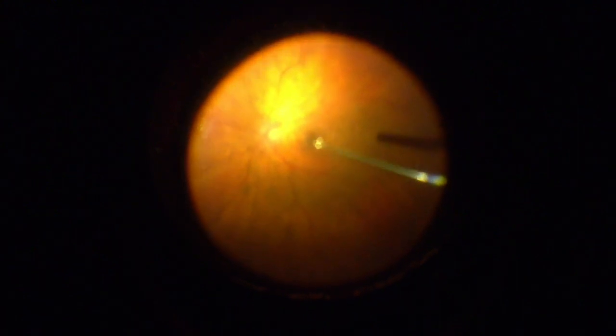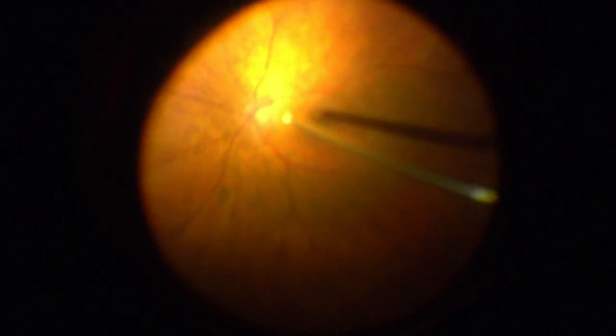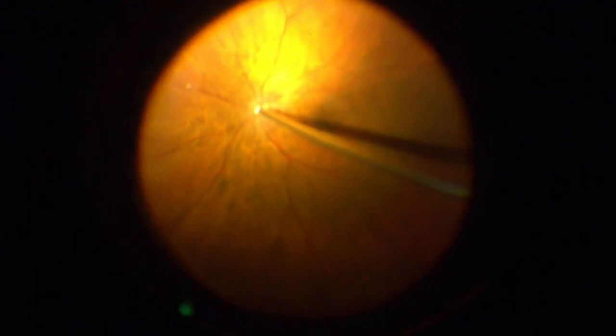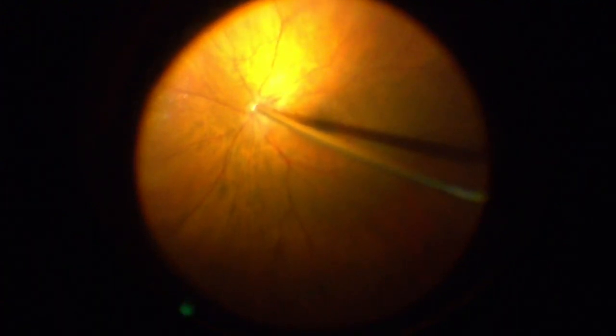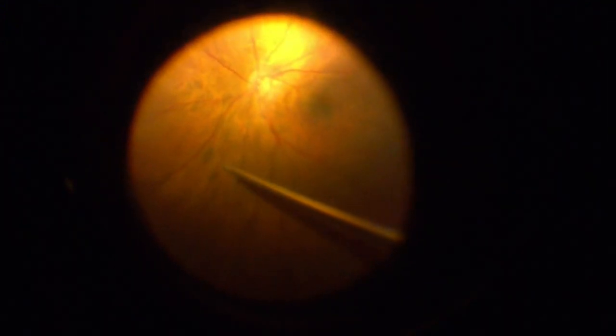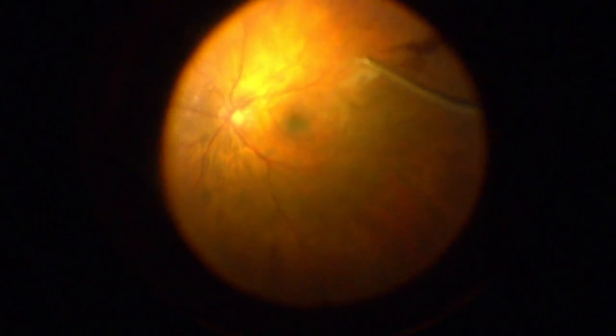As you come down here, can you focus this for us? You can see how it's pooling down there. So the vitreous is still down here at the nerve. So we'll turn the cutter off, turn up the vacuum, and we're going to engage the cortical vitreous here. And what's nice is you can see the shadow out there. Watch the shadow right here as we pull up. I often don't use triamcinolone. And so we just stretch it in different directions. You can see it popping up, very nicely. And here goes the vitreous out temporally too.